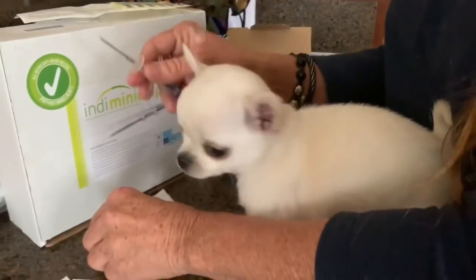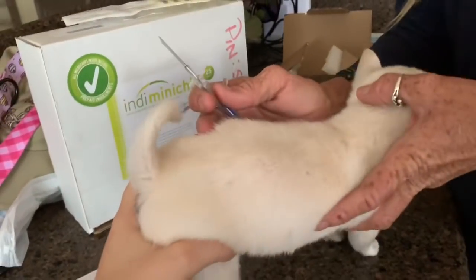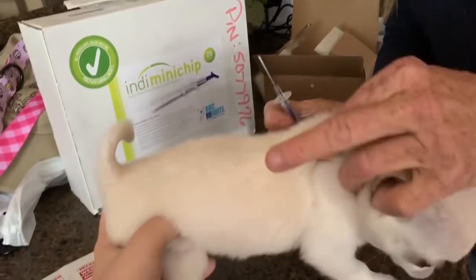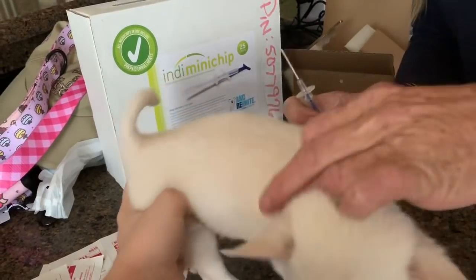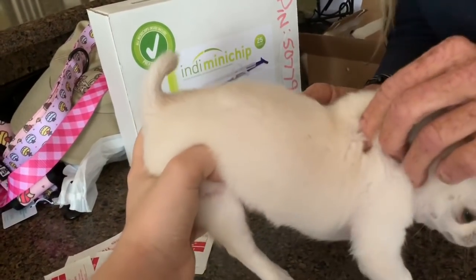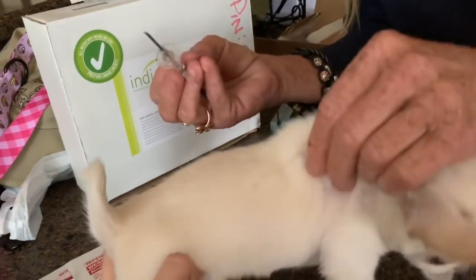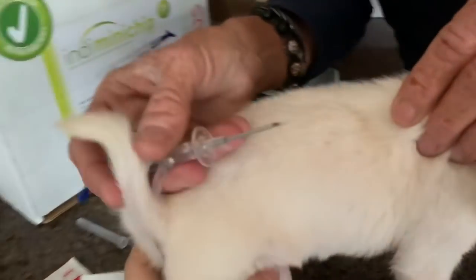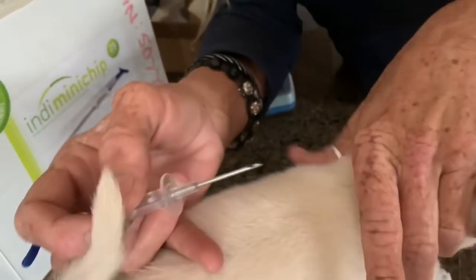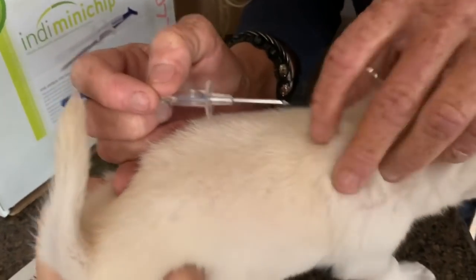This is going to be really uncomfortable for him. The needle is very small — it's the smallest needle they have right now for injecting microchips. Once you have the baby, you want to tent the skin, making sure you just have skin — no muscle, no bone, nothing underneath — right in front of where we just cleaned with the alcohol swab. He's not liking this at all, but I'm not hurting him. He just gets very uncomfortable when being touched this way. We're going to take the needle with the sharp part facing towards the puppy — this makes for an easier injection and it won't hurt as much. We're going to go right into our tent area.